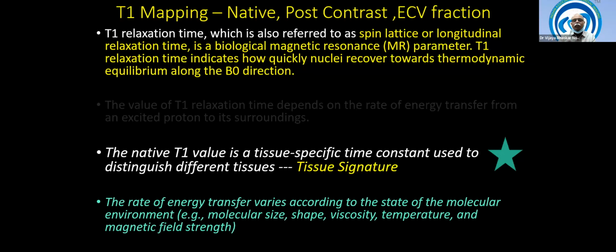That is what is meant by parametric. Comparing the measured values with established values is known as parametric mapping. Where 1000 is normal, I've got 900 normal. If there is 1200, that is abnormal. That is what is meant by parametric mapping.